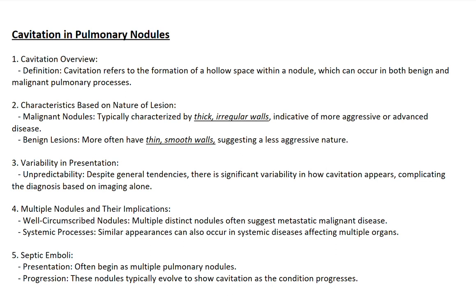Point-wise description of cavitation in pulmonary nodules. 1. Cavitation overview. Definition. Cavitation refers to the formation of a hollow space within a nodule, which can occur in both benign and malignant pulmonary processes. 2. Characteristics based on nature of lesion.